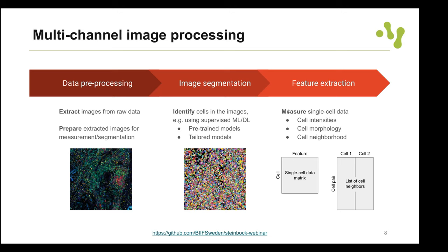DeepCell is the package that ships the Mesmer pre-trained neural network, which is already downloaded within the Steinbock Docker container. There's an additional argument to apply max scaling before segmenting the images. What this generates in our data folder is a 'masks' folder in which so-called cell masks are saved — grayscale images of the same size as the input image with a single channel.